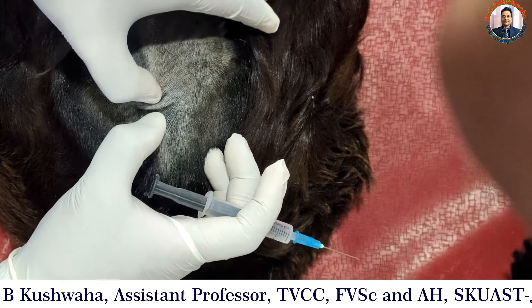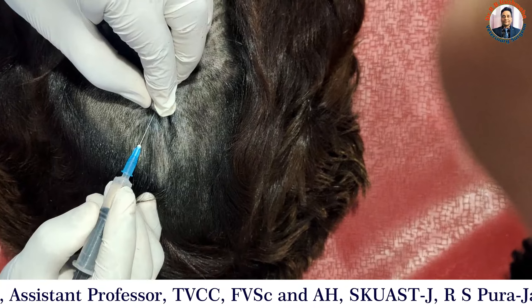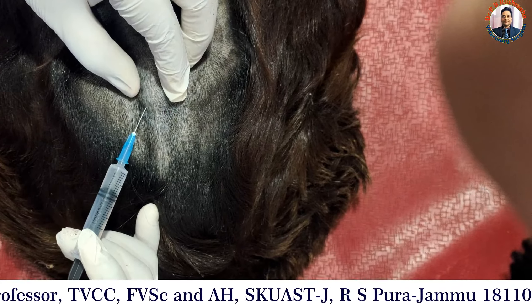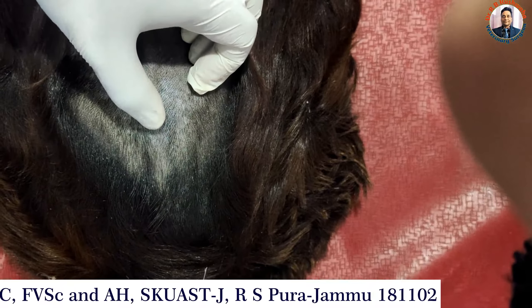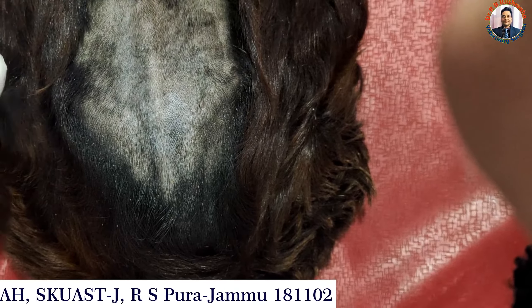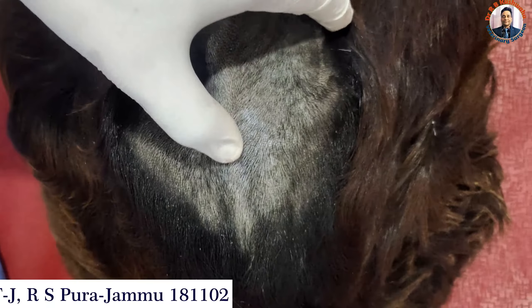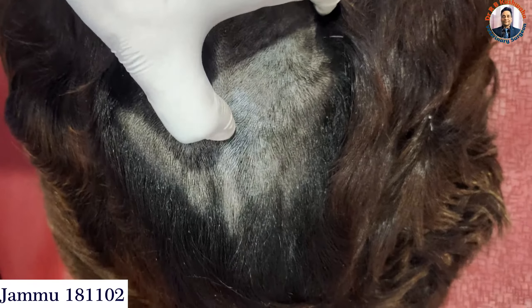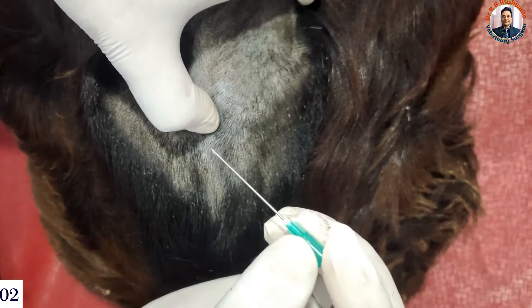First we administer 0.5 ml of a local anesthetic agent to desensitize the skin, so that when we insert the actual needle there will not be any pain. After making a wheal and desensitizing the lumbosacral junction, we proceed to the next step.